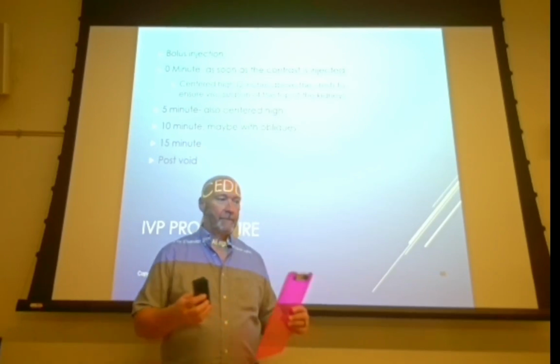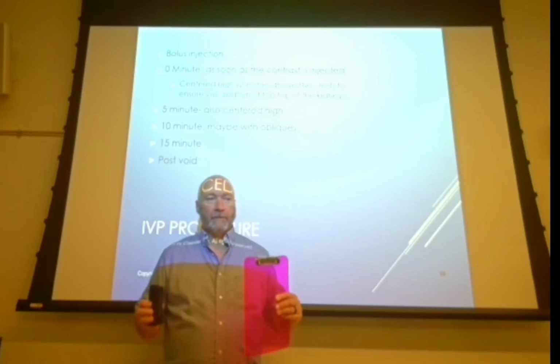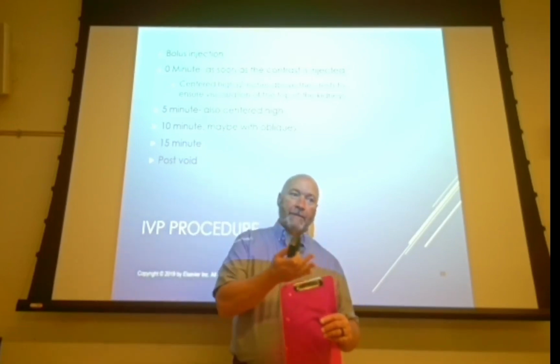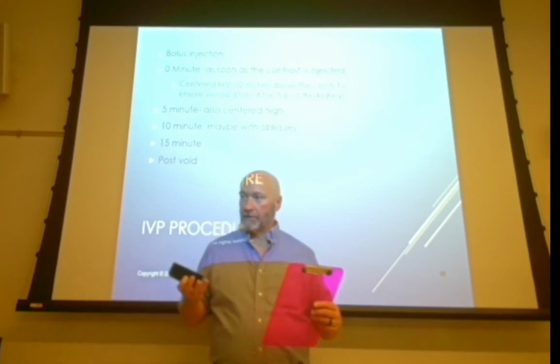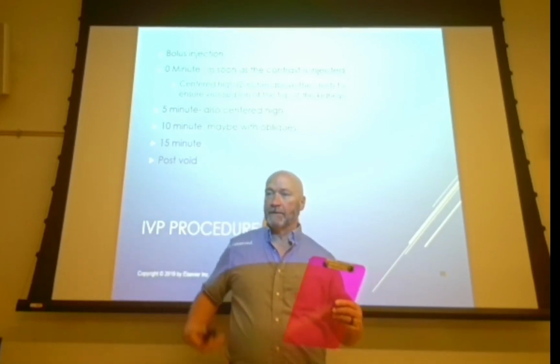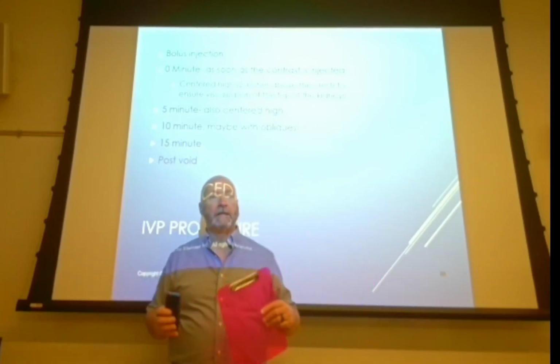That's going to be patient specific depending on their weight. So what we're going to do then is take our first image to make sure that we get the top of the kidney. We're going to position it more like an AP of the L spine without collimation. So we're going to make sure it's kind of high, positioned kind of like an upright abdomen, right? So go above the crest, about 2 inches above the crest. Make sure you get the top of the kidneys.